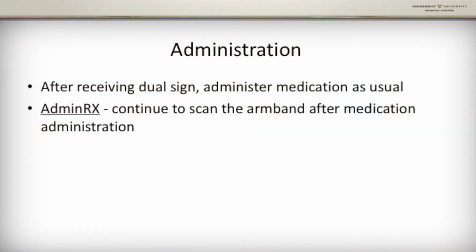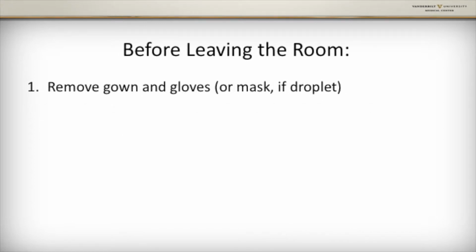After the medication has been co-signed, you can administer the medication as usual. In AdminRx, you will need to continue to scan the armband after the medication has been administered. Before leaving the room, you will need to remove your PPE and then foam out.